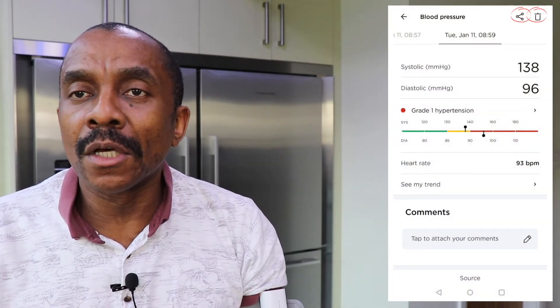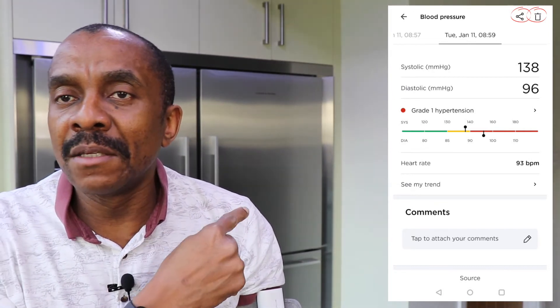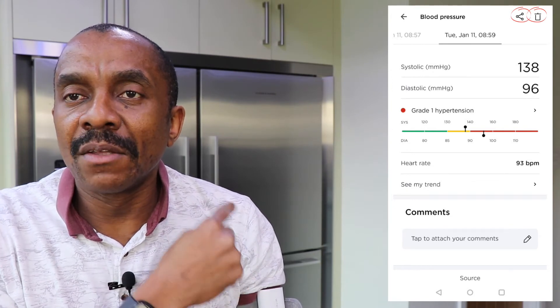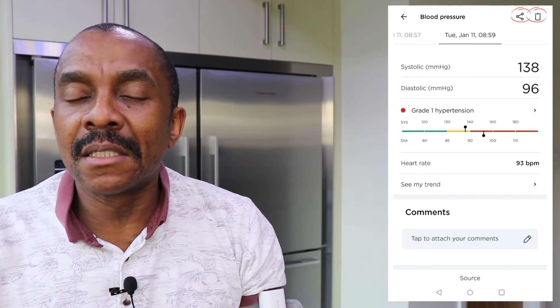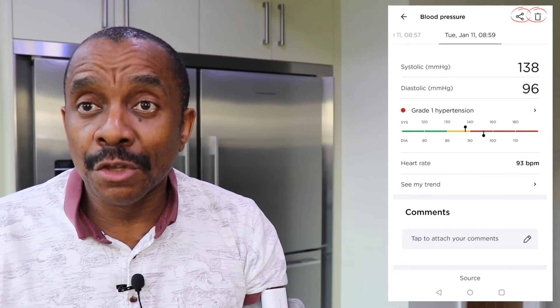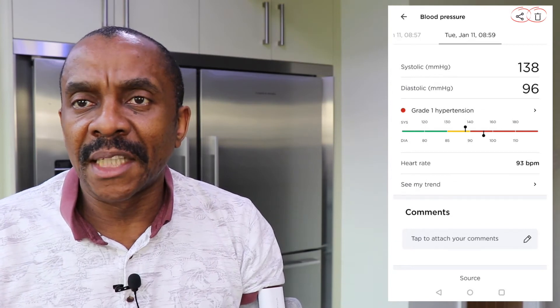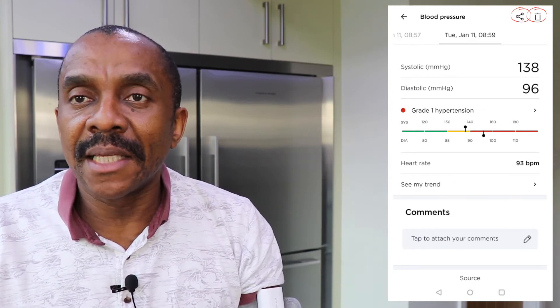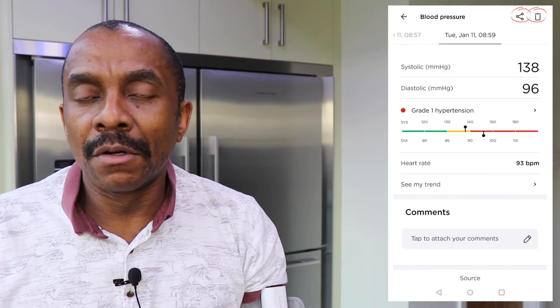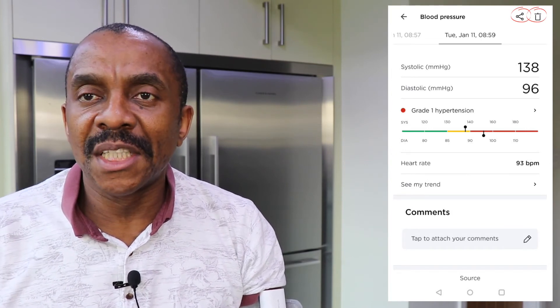You can send your blood pressure readings to your doctor or whoever you want to share them with using the share button on the app. You can also delete a blood pressure reading — so if you've taken three readings and one appears to be an anomaly, you can delete it and take another reading. You can do that by touching the delete button on the app.